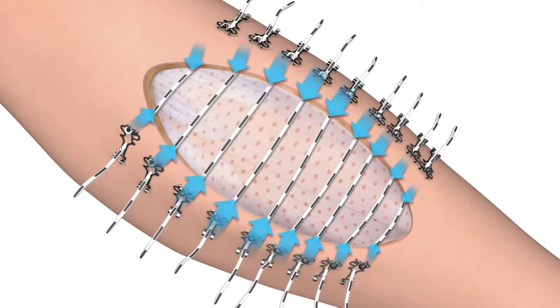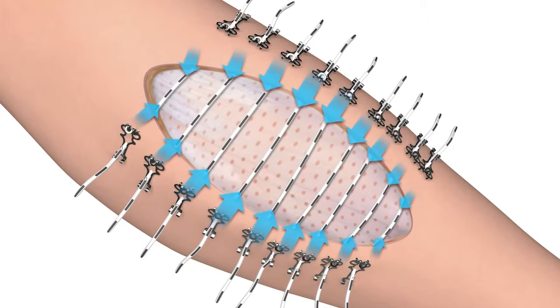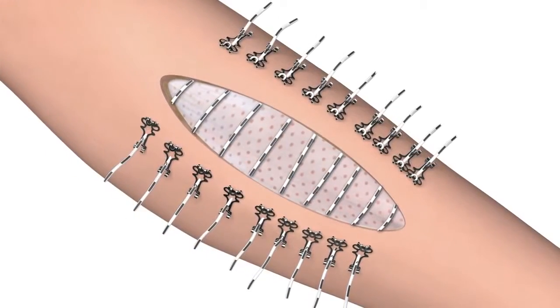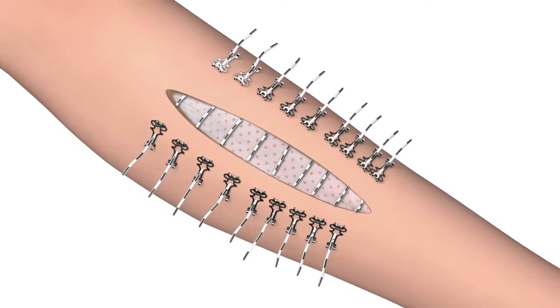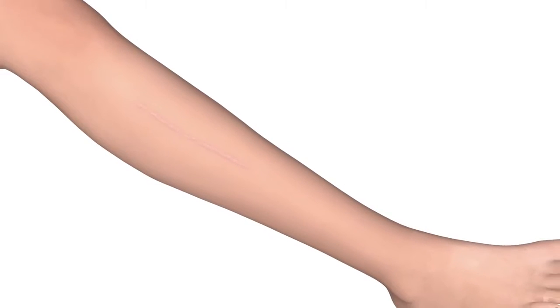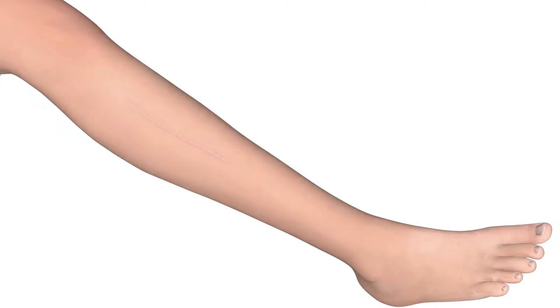Unrelenting moderate tension is essential for retraction prevention after a fasciotomy. With early application and diligent adjustment of the devices, additional surgeries are avoided and delayed primary closure can be achieved sooner.